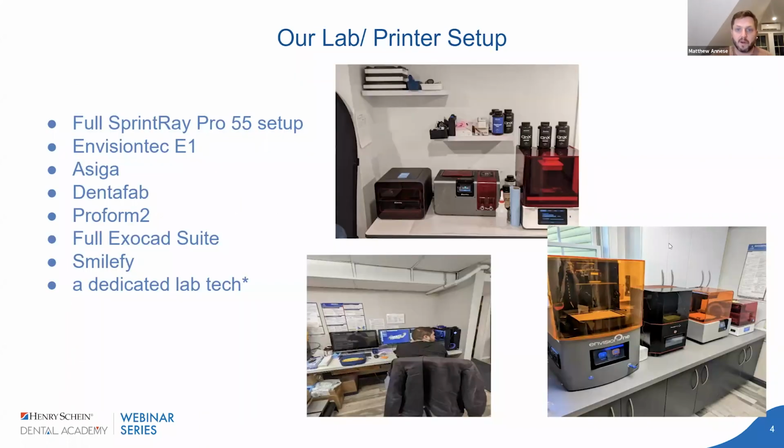This is the setup. So these are the printers I have. As you'll see, I'm agnostic to printers. I'll mention a few companies. I'll mention some startups, but I don't have a stable of one company. I think they all provide different services. I use them for different things. They have different resins that have benefits. The speed, the accuracy, the workflow.